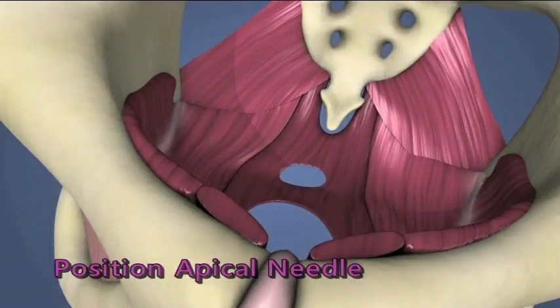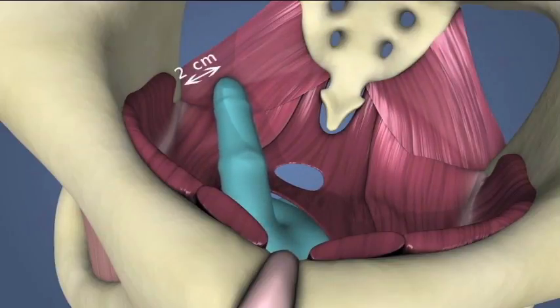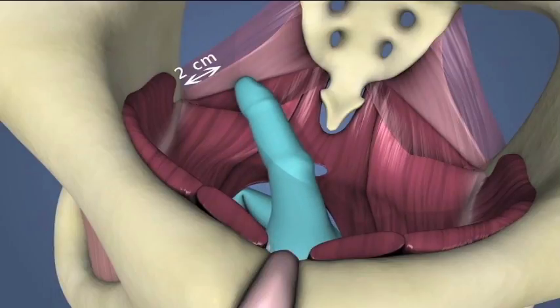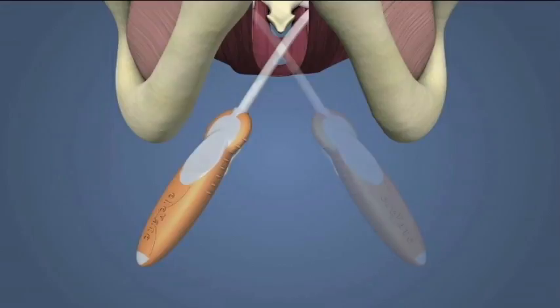Positioning the Apical Needle. To position the apical needle, locate the sacrospinous ligament by palpation. While keeping your palpating finger on the ligament, guide the tip of the loaded needle and sheath alongside and lateral to the finger towards the ligament. For patient left, hold the needle in the 5 o'clock position. For patient right, hold the needle in the 7 o'clock position.